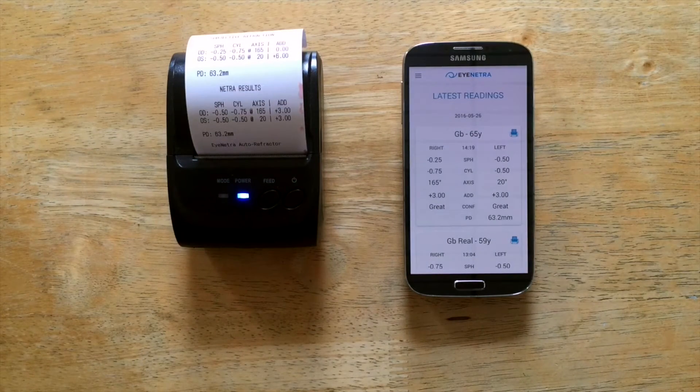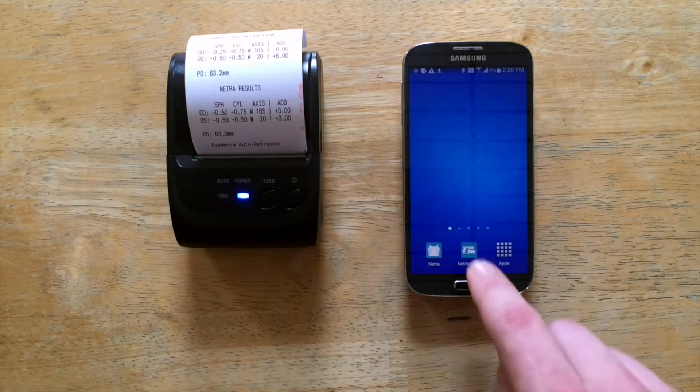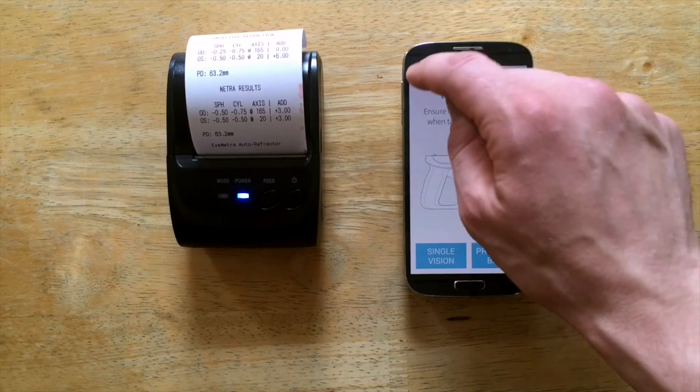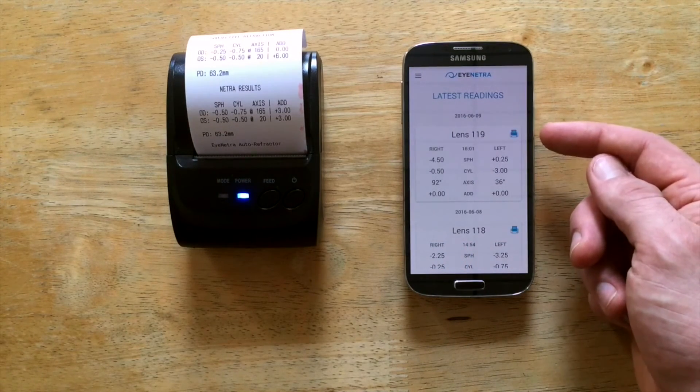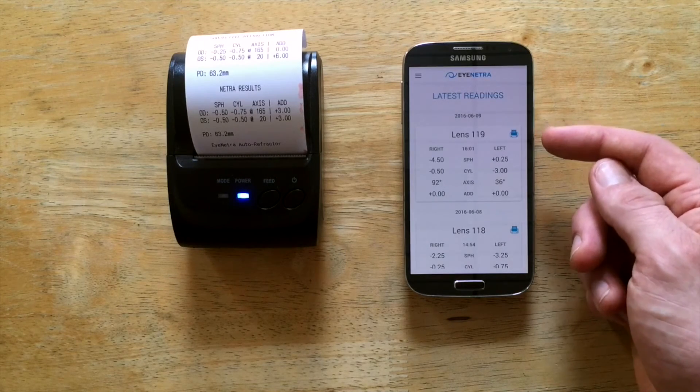The same applies to Netrometer. I open up my Netrometer app, select Readings. My icon will appear — simply tap the icon to print.